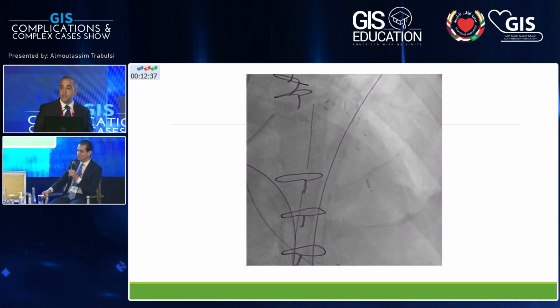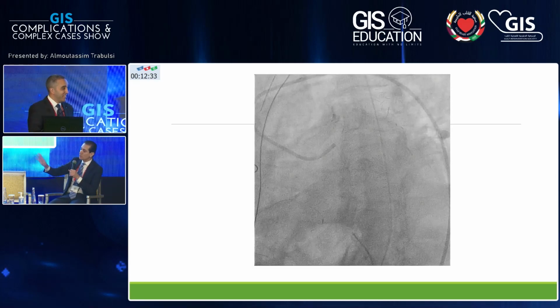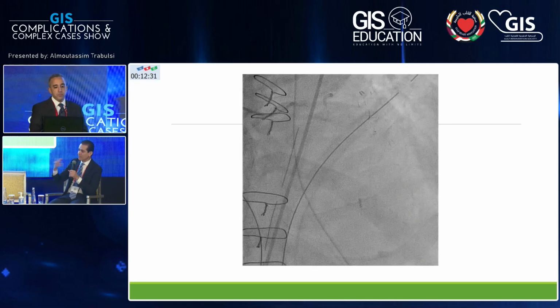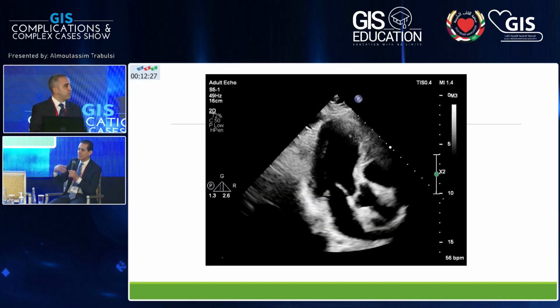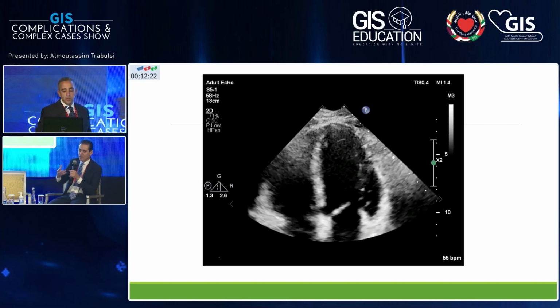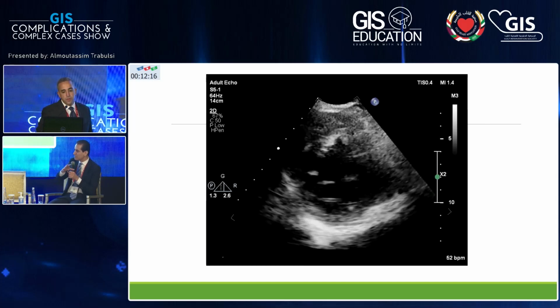Before the surgery, I can go back all the way. I think that's actually a great question. One of the challenges we face, and I face, anytime the LAD is occluded and fills by collaterals, you think you can see the LAD, but you may not see the LAD well, and whether it's a good target vessel or not. And I think this was the case here.